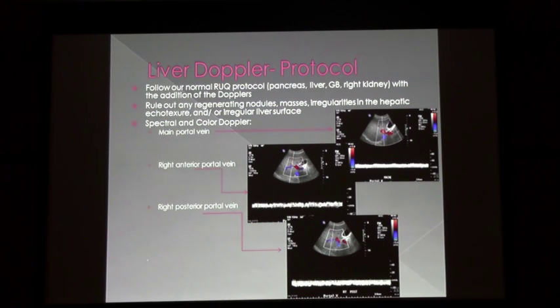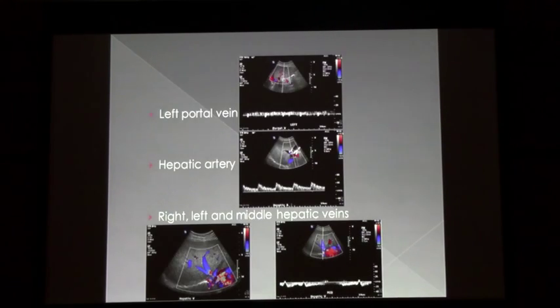Of course, if things have changed, that can be different. We also look at the left portal vein, the hepatic artery, and then each of the hepatic veins.